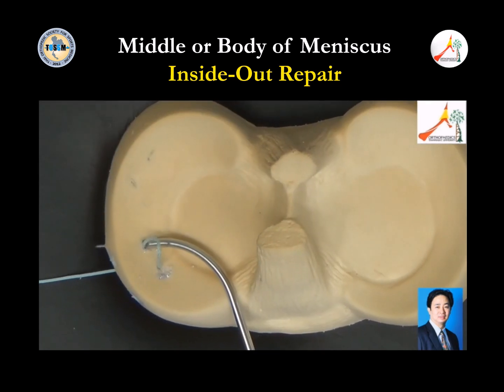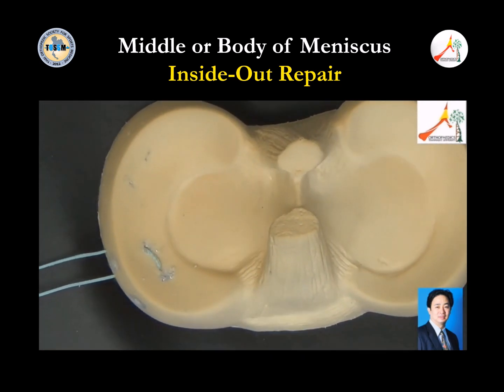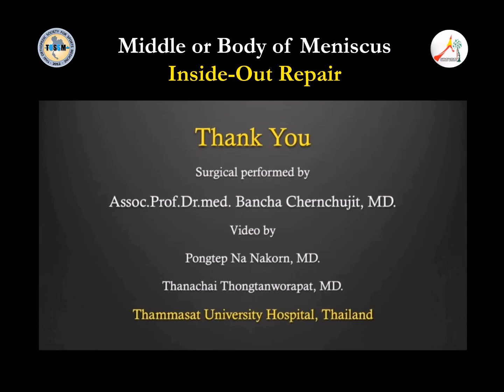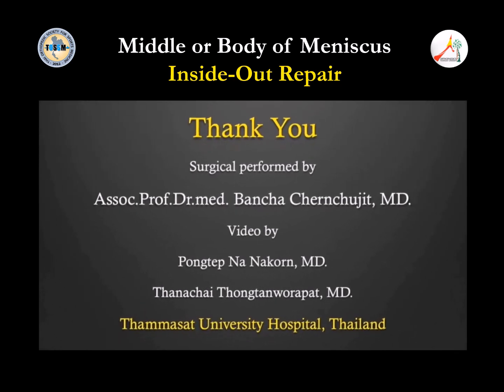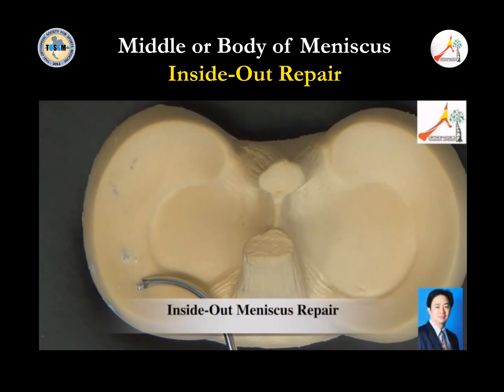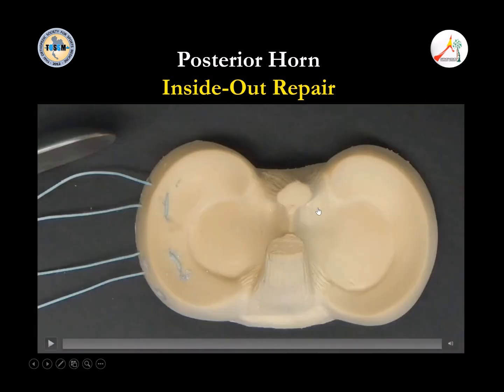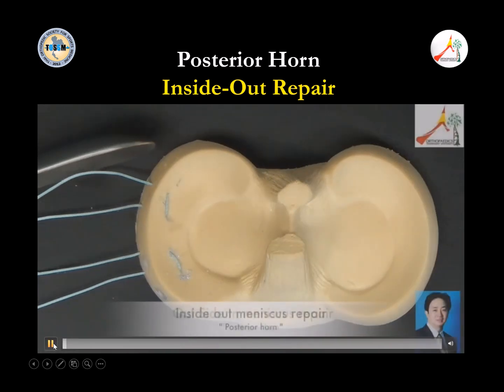Okay, the way we protect the tip of the needle, see, and then pull them out. Okay, this is the meniscus inside out. And finally you make a small incision and repair the meniscus on the capsule. Okay, in case you want to repair the meniscus in the posterior horn, like this.